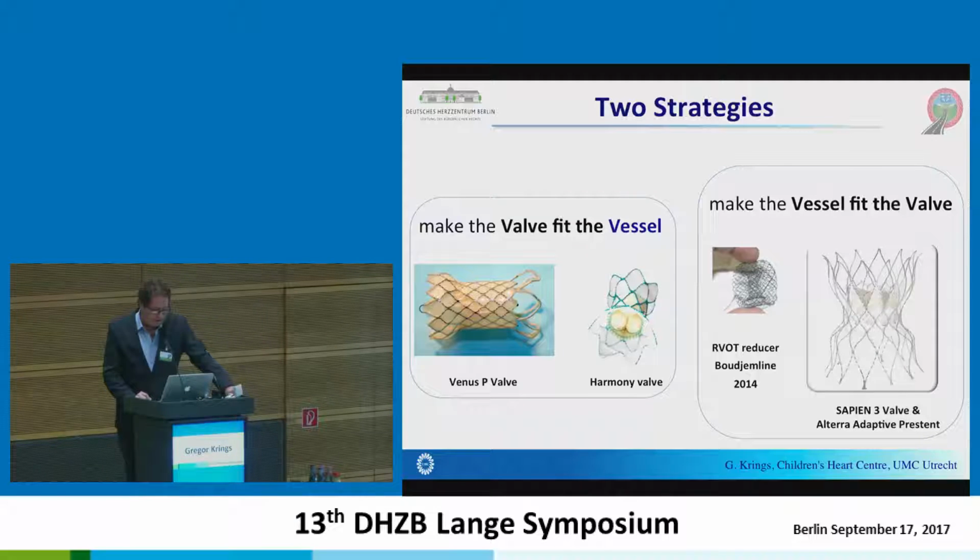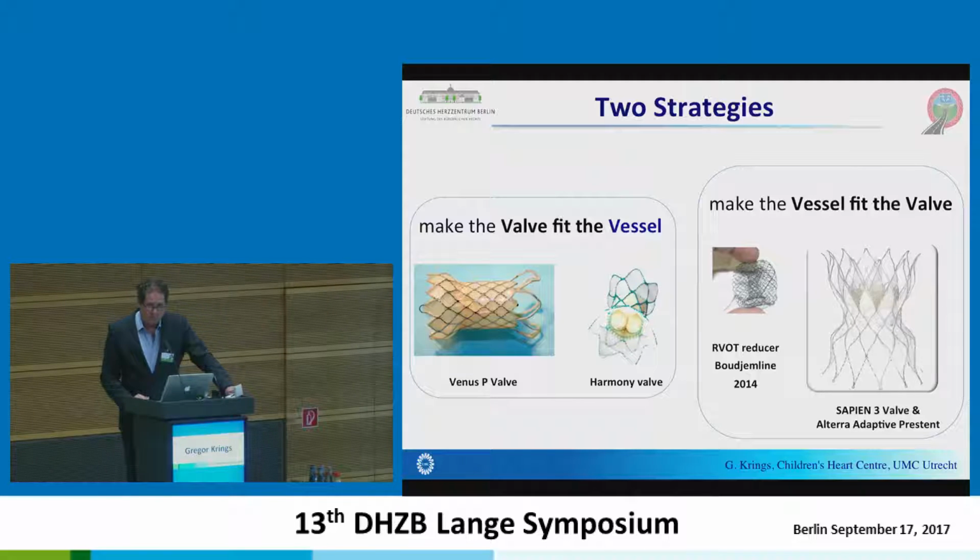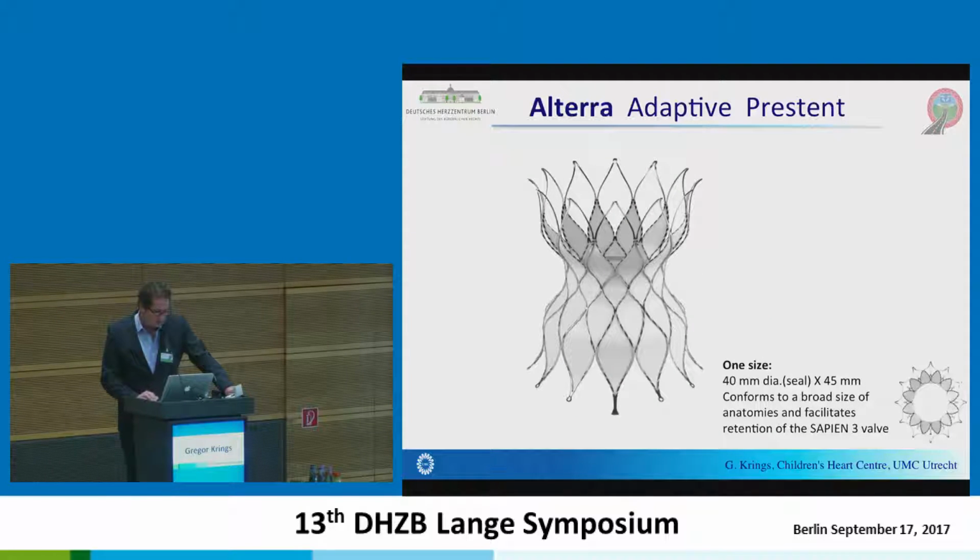So this is the Alterra stent. You get an idea how the design is, and then within the Alterra stent there's a 29 Sapien mounted. And what we did at the animal experience, and I only was taking part of the smaller number of those, a couple of people participated, was implant the Alterra device, and then immediately, in most of the cases, without any kind of 3 months or 1 month healing time or fixation time, whatever, we straightforward went for implantation of the 29 Sapien. So what are the characteristics of the Alterra stent?